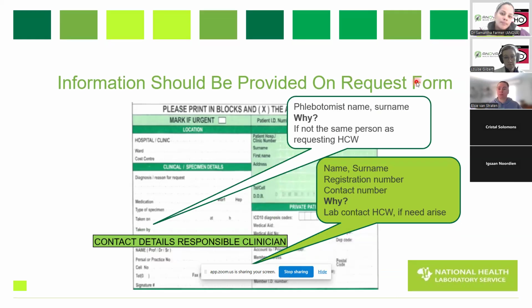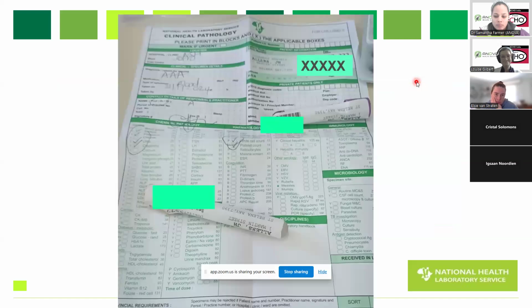Then you, as the person consulting and perhaps also taking the sample, put your name on, your SANC number, your MP number, and a contact number. Sometimes we want to phone you and say, look, doc, your result is this, your result is that. Far too often we can't get hold of people with the results. And if you are writing, then write legibly. Maybe you can make out what was written here, but I can't make out that little squiggle over here. If these electrolyte results were high, or this urea, I would not be able to call out this person. So write legibly, write clearly, give us the relevant information. It helps us in the lab.